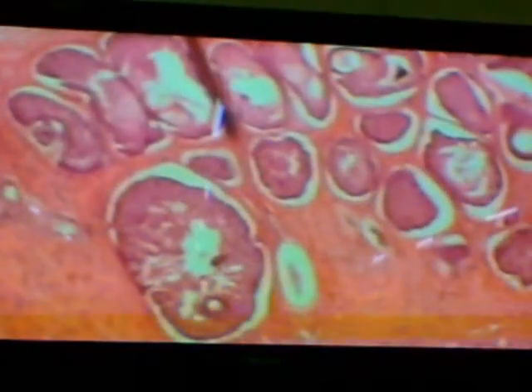Oh, I was on the top section, close towards the fornix. Right, so I left there and I am coming right down towards the tip, towards the edge of the eyelid. Within the eyelid I have the tarsal plate here, which is in the posterior lamella, and I'm coming right down to the tip. Yeah, and even right in the tip, you notice what I'm seeing here?